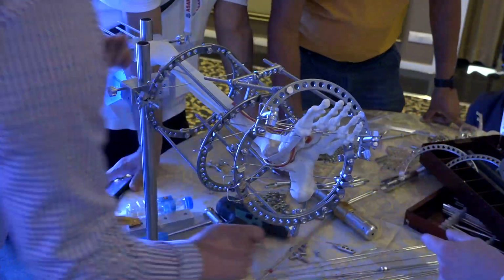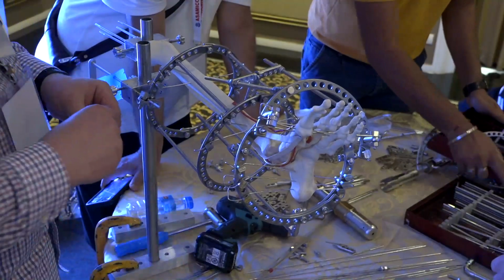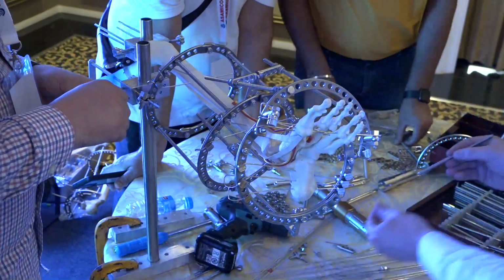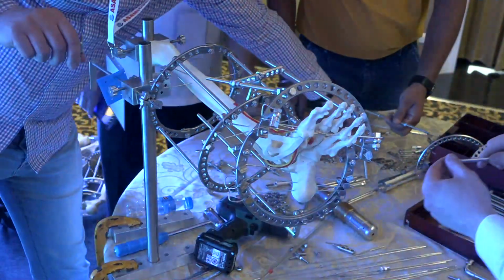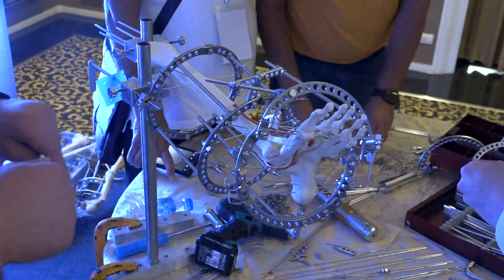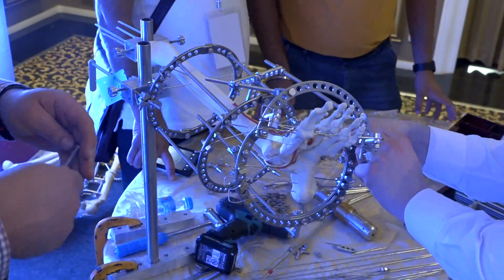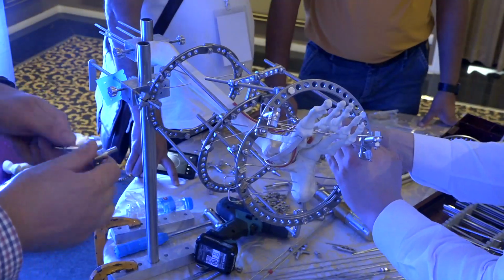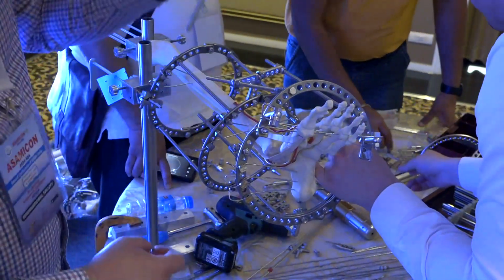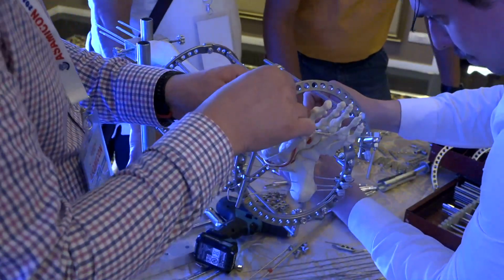One hole. Yeah. And the longest rod. No, it's one more rod. Prepared the hinge with two female posts. Just give me a plank. Short plank. So, and now I will put the last rod with the hinges for cavus deformity correction.